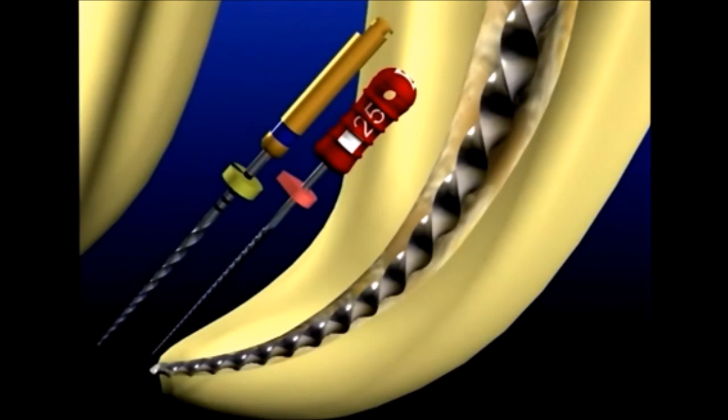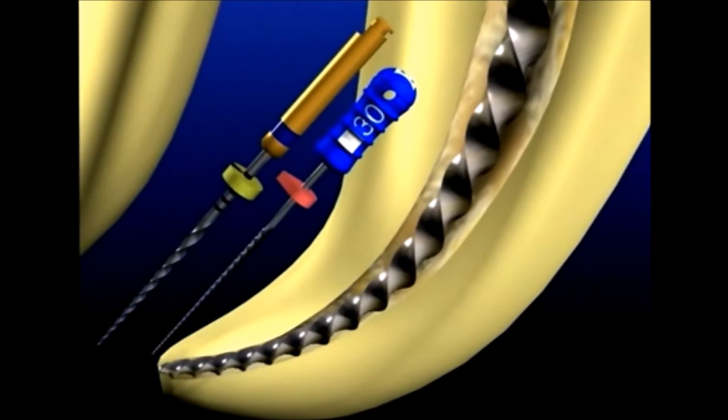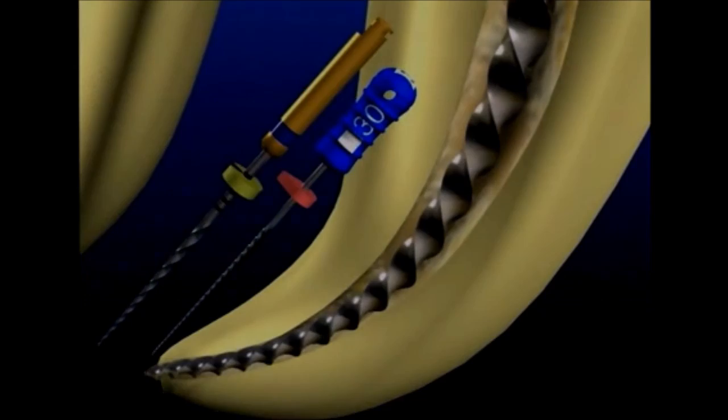Finisher 3 is a 30 at D0 and has a 9% taper. And, following its use, we again gauge the foramen using a 30 hand file. If the 30 hand file is snug at length, we're ready to pack. In the event the 30 hand file is loose, there are a variety of techniques that we'll talk about shortly that can finish the apical 1/3.